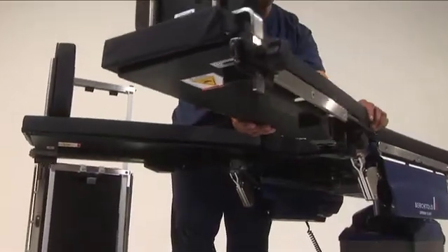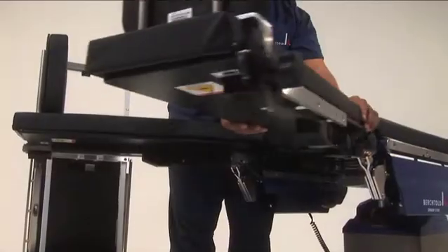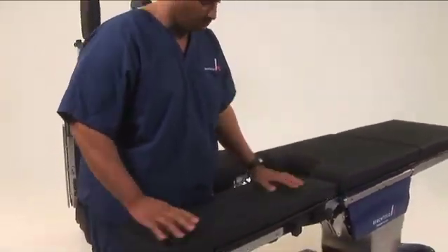To abduct or adduct the legs, this knob will loosen the joint for patient positioning. The removable pads on each section allow you to position them for optimal patient comfort.